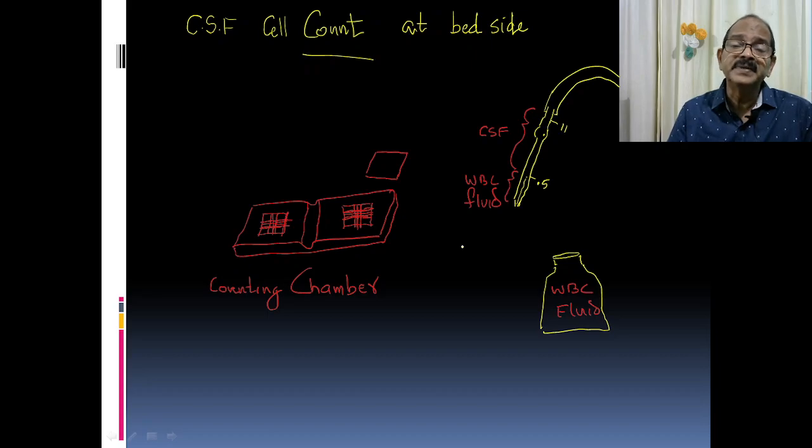The materials we need are familiar to us. This is the counting chamber used for RBC and WBC counting. This is the WBC pipette, and this is the WBC fluid. When we take WBC counting, we take blood up to 0.5 and then add the WBC fluid.